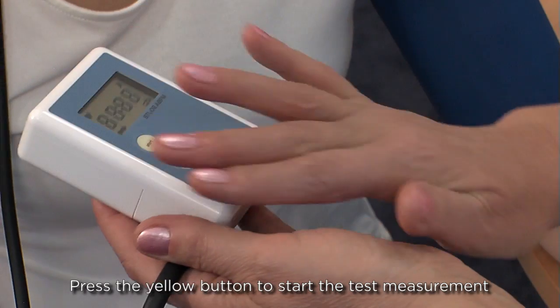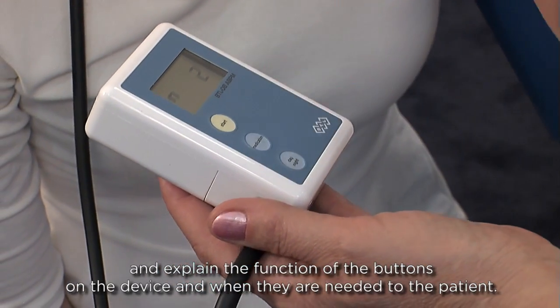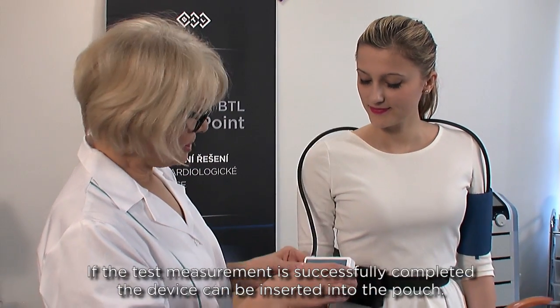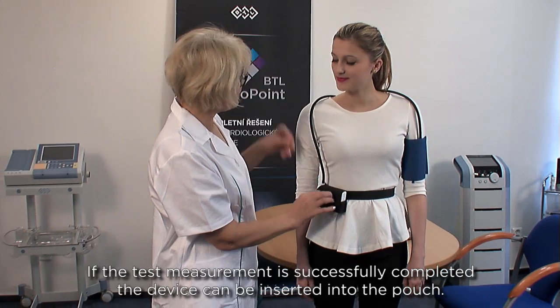Then press the yellow button to start the test measurement and explain the function of the buttons on the device and when they are needed to the patient. If the test measurement is successfully completed, the device can be inserted into the pouch.